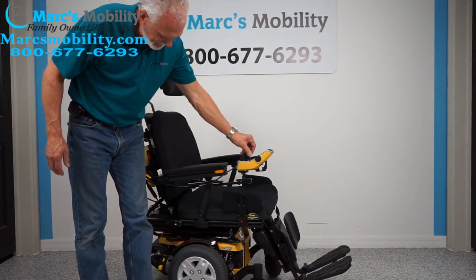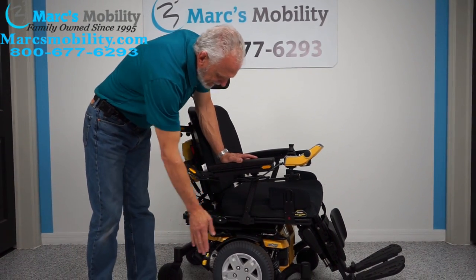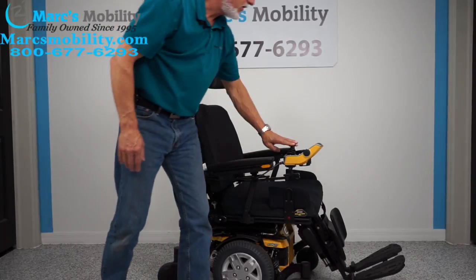That button for the lights is right here — that turns the lights off and on.